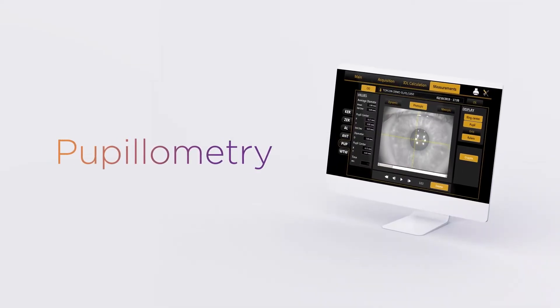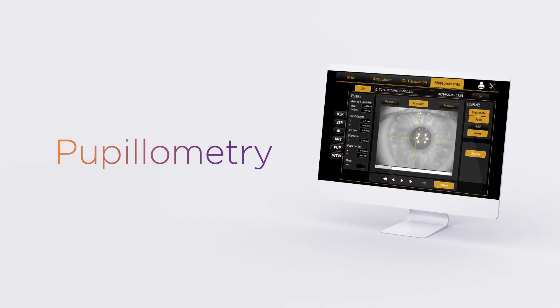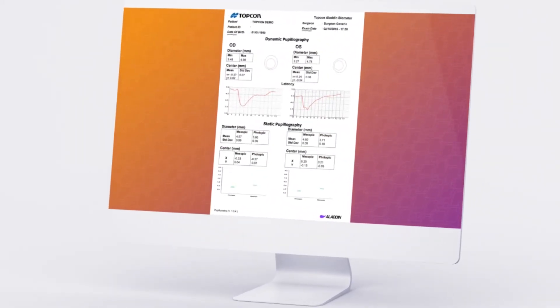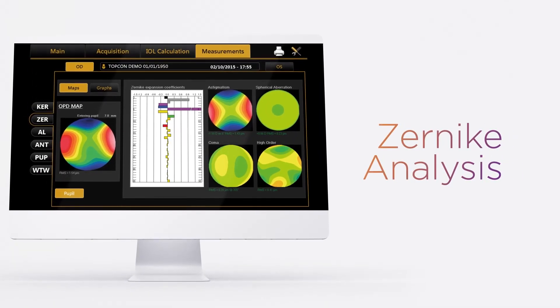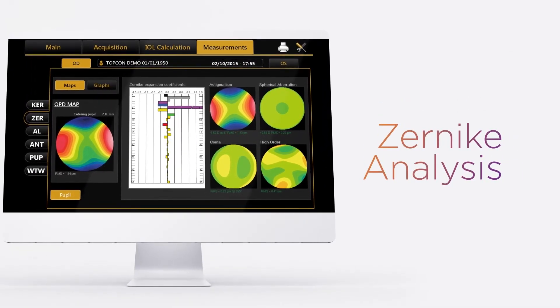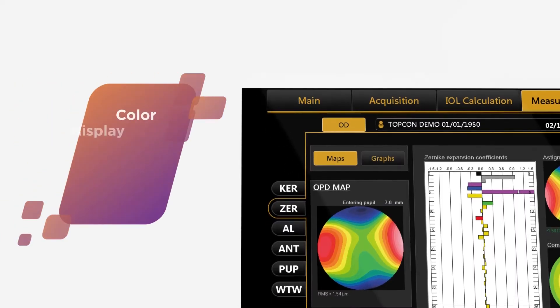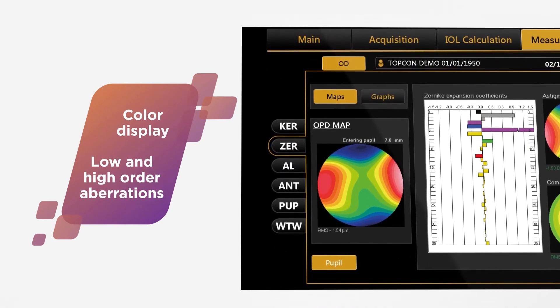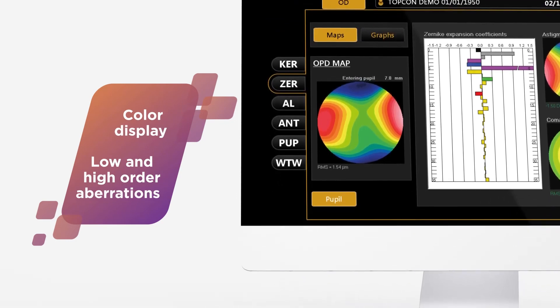The pupillometry report shows the infrared image of the pupil in maximum and minimum diameters, and the latency graph of the pupil response after the reading. Aladdin performs a wavefront analysis of the aberrations on the anterior surface of the cornea using Zernike coefficients. The maps are displayed in color and show low- and high-order aberrations, such as coma, astigmatism, spherical, and high-order aberrations.